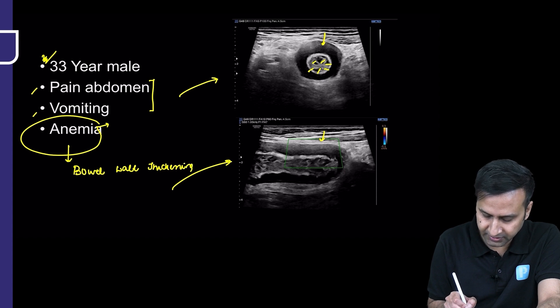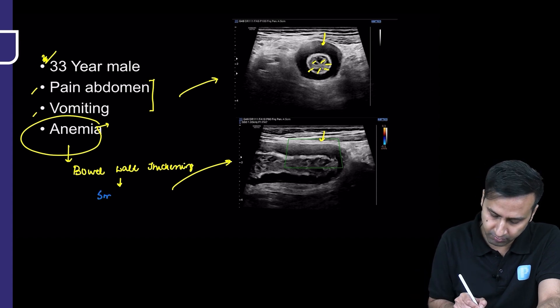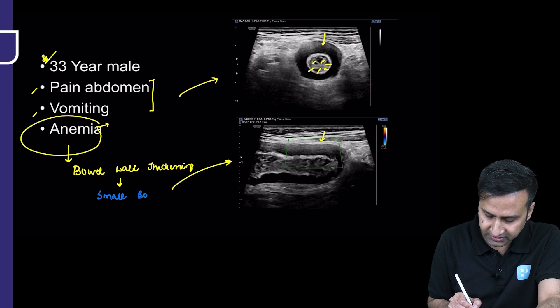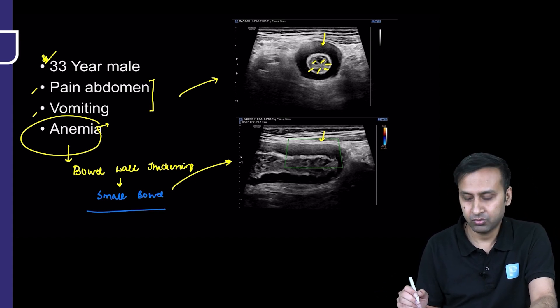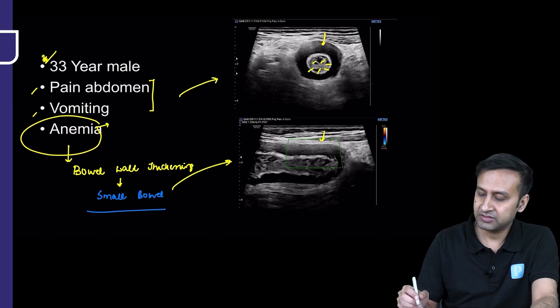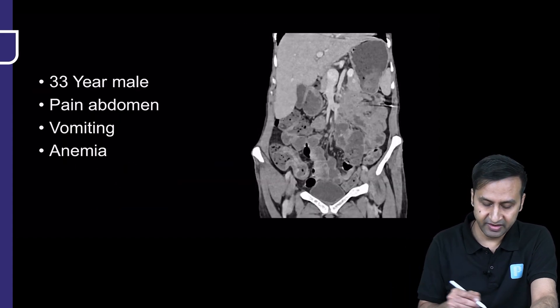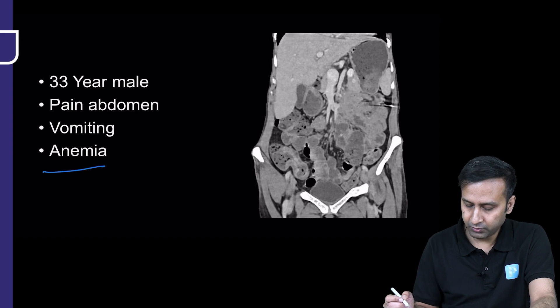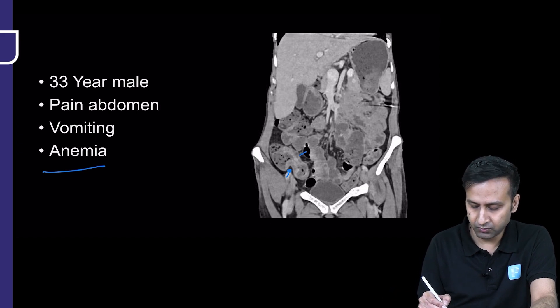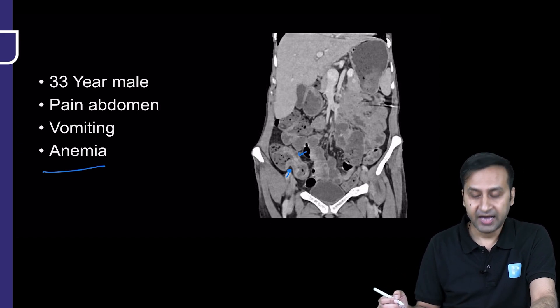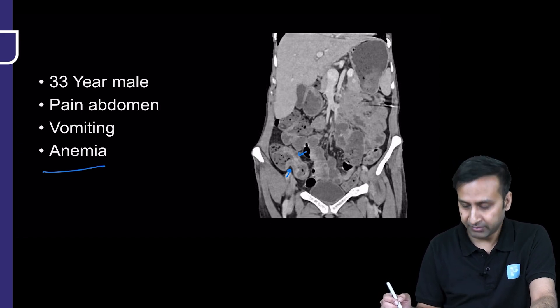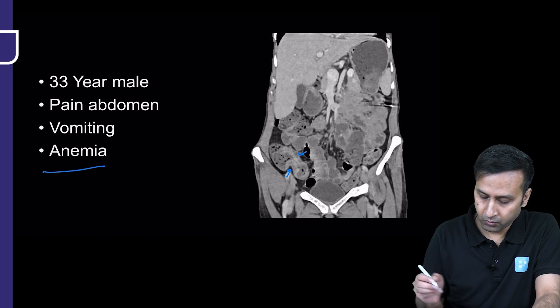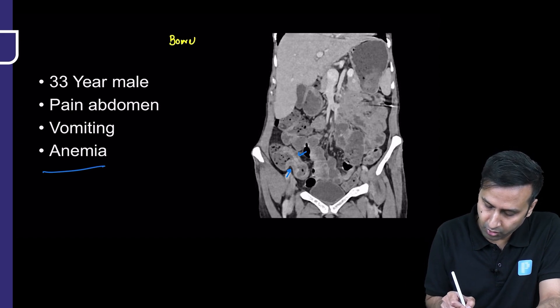This thickening is involving the small bowel. In cases with suspected small bowel thickening, the first investigation we do is a CT enterography. On CT enterography of this patient, the area of thickened bowel was the terminal ileum at the ileocecal junction. Important observation number one: there is abnormal bowel wall thickening.